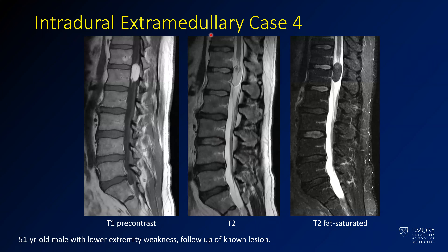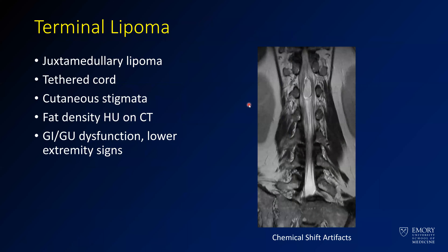Here's another intradural extramedullary lesion. This is T1 — the CSF is dark, but this lesion is very bright on both T1 and T2. When you apply fat suppression, it gets dark. There's also a chemical shift artifact around it on T2. This tells you you're dealing with a juxtamedullary lipoma — a lipoma of the conus, called a terminal lipoma. It can be associated with a tethered cord and cutaneous syndromes like port wine stains. These will suppress on fat-suppressed imaging, and you'll also see chemical shift artifact. On CT, they'll be fat density. A fatty filum is a single linear fat signal structure; when it becomes more mass-like, we call it a terminal lipoma.